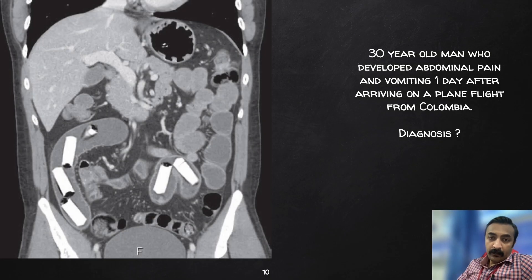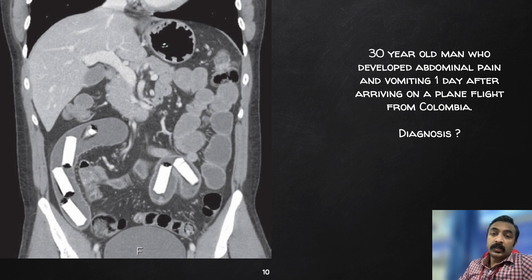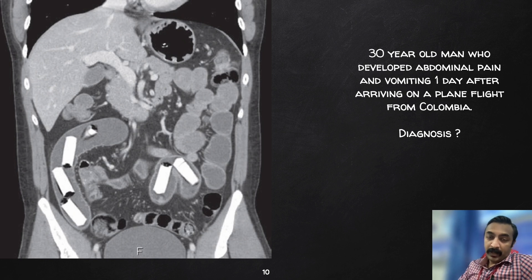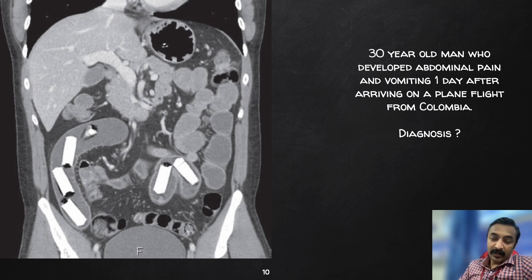Here we have a CT abdomen of a 30-year-old man who developed abdominal pain and vomiting one day after arriving on a plane flight from Colombia — though it could be anywhere in the world. So what could be the diagnosis? You can see something very interesting in this image.